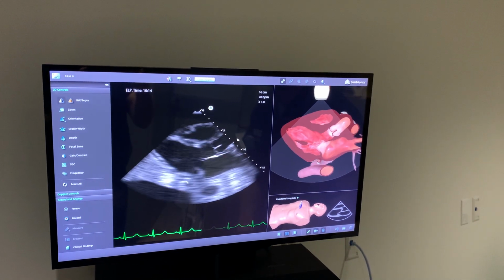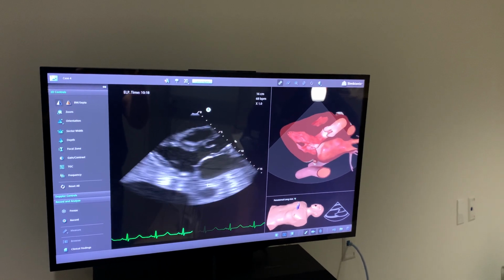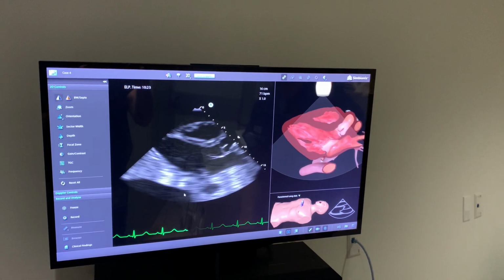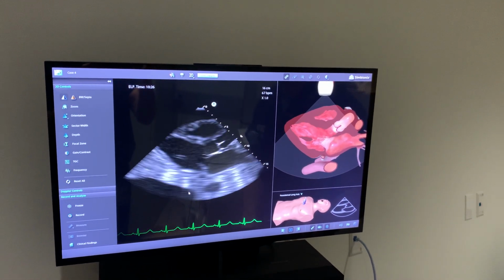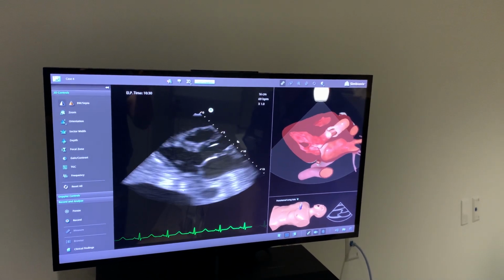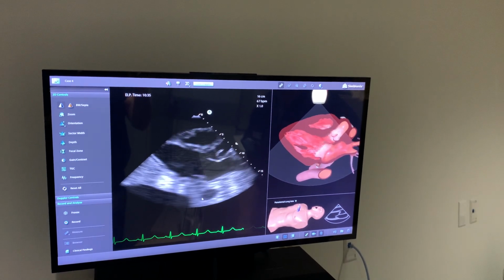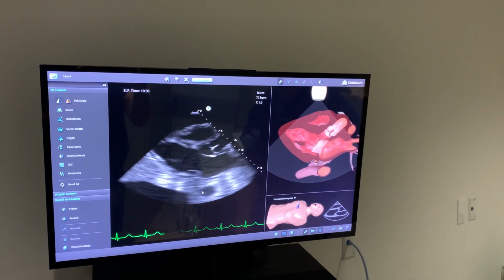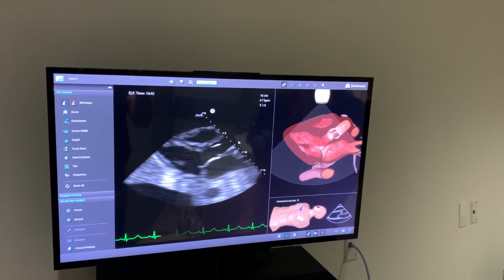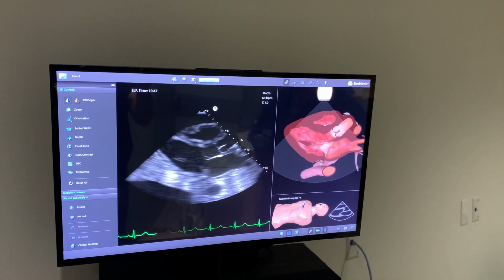This patient, in this view at least, doesn't have a pericardial effusion, which we would see as fluid collecting posteriorly. It would collect between the heart and the descending aorta. And fluid is black. Fluid is black, yeah, thank you. A pleural effusion, you could also see sometimes in these views, that also collects posterior to the heart, but it would be posterior to the aorta here, as opposed to a pericardial effusion, which is between the heart and the aorta. So that's why Mark earlier had changed the depth to be able to see the aorta, which can help with the pericardial effusion versus pleural effusion question. Exactly.